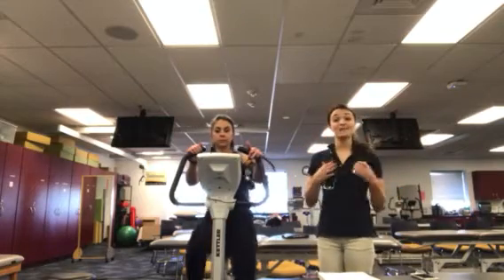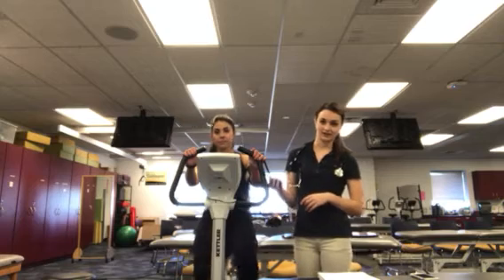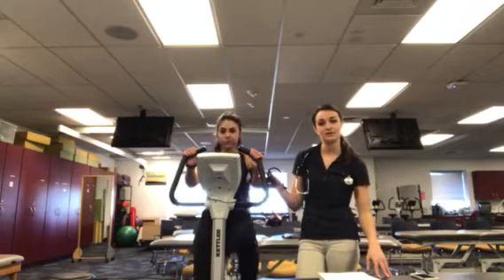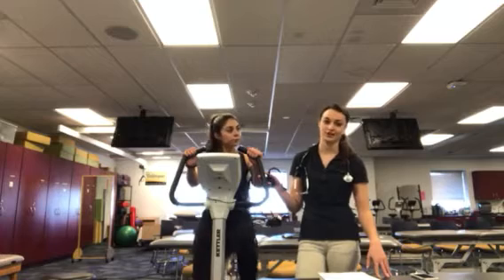All right. Hi, my name is Erin, and this is Brooke. We're going to be doing an Astrand cycle test today. I'm also Brooke's acting physical therapist. This is a submaximal test that we're going to be looking at, and this is a way that we can predict Brooke's VO2 max so that we can properly prescribe her exercise.